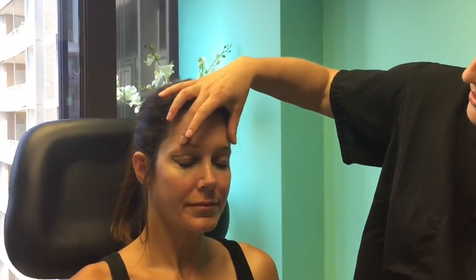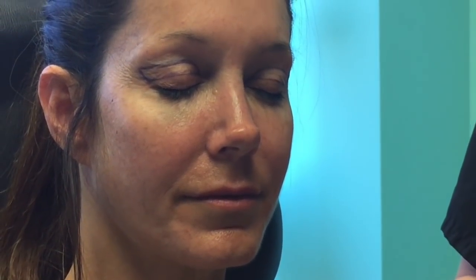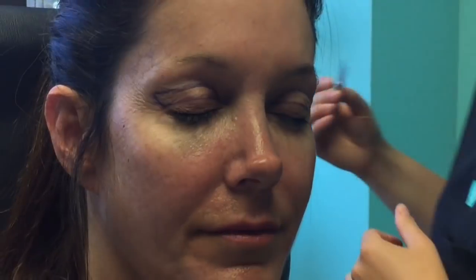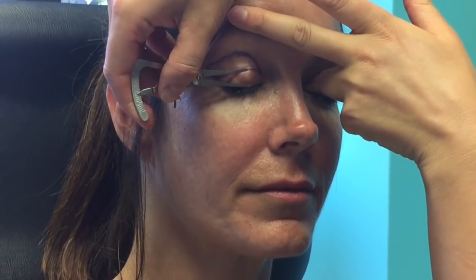Here I'm going to demonstrate the markings. The markings for the eyelids have been placed at her natural eyelid crease. I use calipers, which are very precise measuring instruments, to measure these markings. I first mark her natural eyelid crease and use that to make sure both eyelid creases are equal on both sides. You can see the creases are measured with the calipers for exact, precise measurement — very precise on this side too.